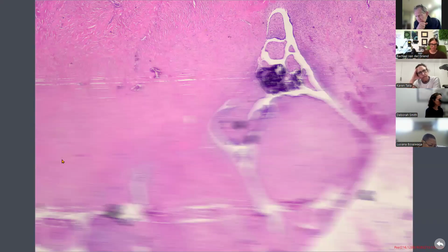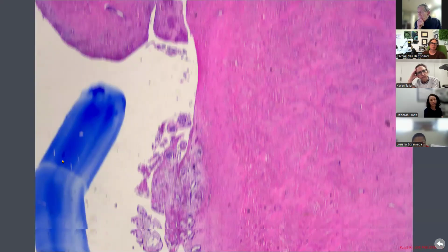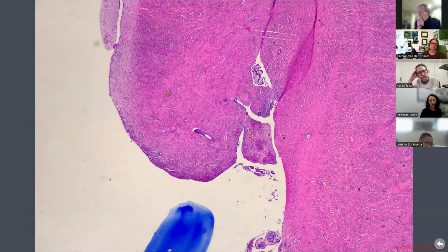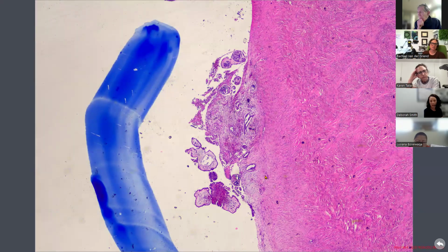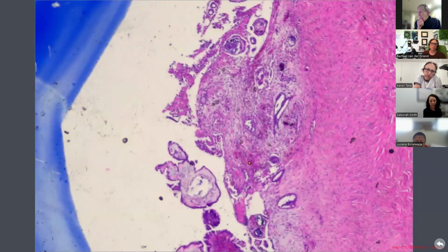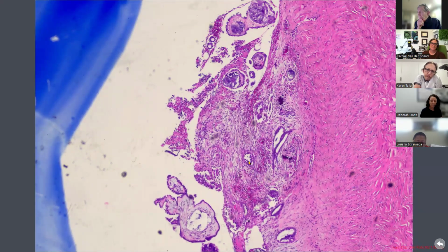Sorry, I'm trying to find my right section here. That's one. So this is elsewhere. If you keep moving around, we now have more surface, again minimal proliferation, but still present. But as we dug deeper into this case, we found that she actually has implants across the surface of the ovary and also up into the abdomen. So this is an autoimplant because it's on the surface of the ovary. But you can see that classic thing where it's very shallow. It looks like it could be pulled off. Oops, got a bit of high power there.